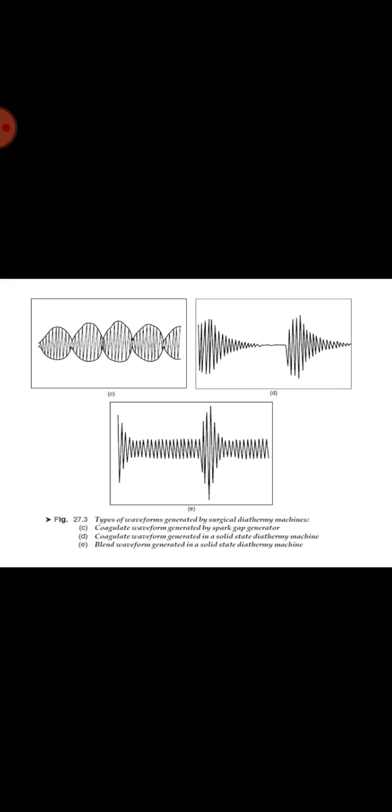A voltage of approximately 200 Vp is required in order to produce the electric arc between a metal electrode and biological tissue. If the voltage is less than 200 Vp, the electric arcs cannot be triggered and the tissue cannot be cut. The voltage suitable for cutting biological tissue ranges between 200 Vp and 500 Vp.